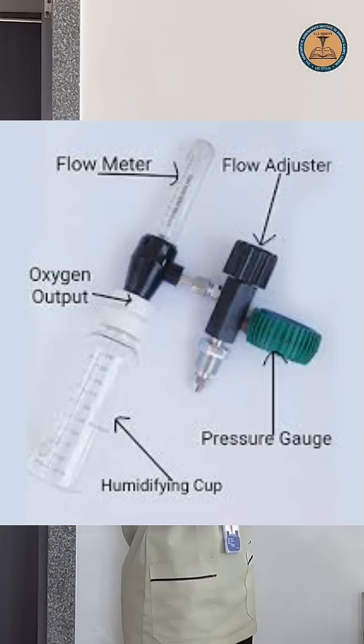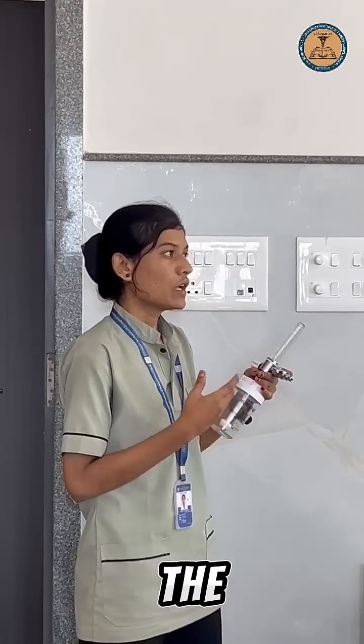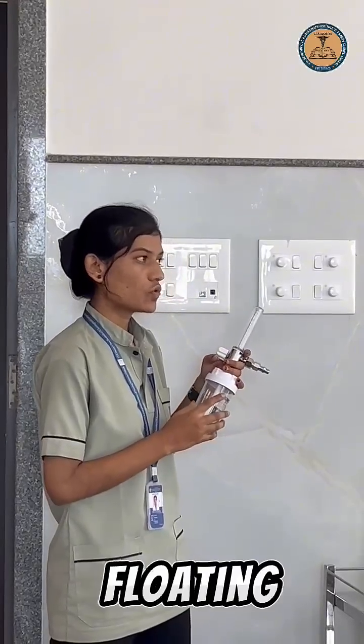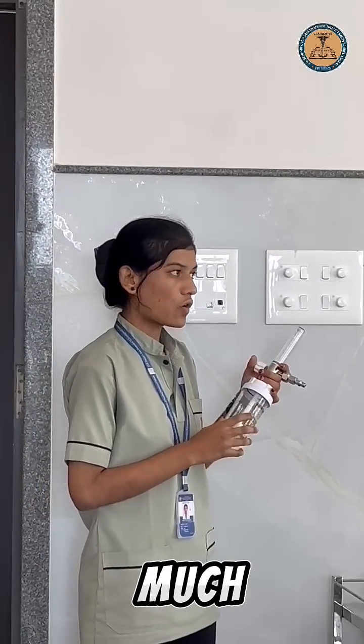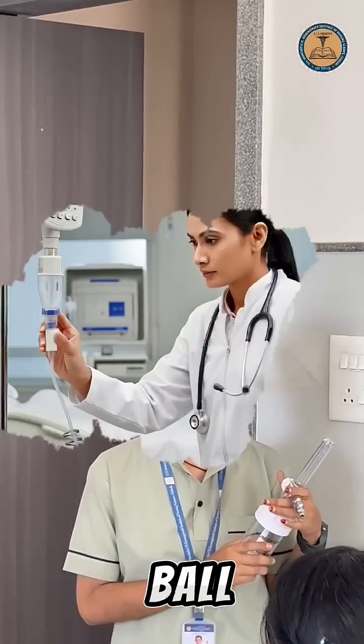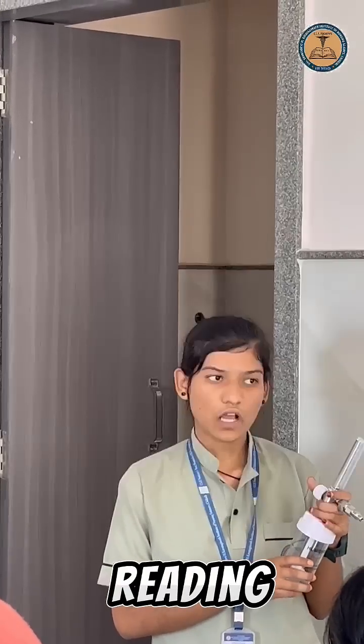Working principle. The oxygen passes through the flow meter where the flow rate is adjusted by rotating the knob. The floating ball rises to indicate how much oxygen is flowing in liters per minute. The nurse must read the ball from the center to get an accurate reading.